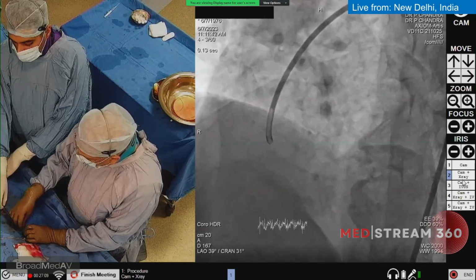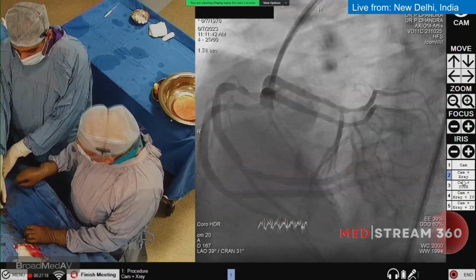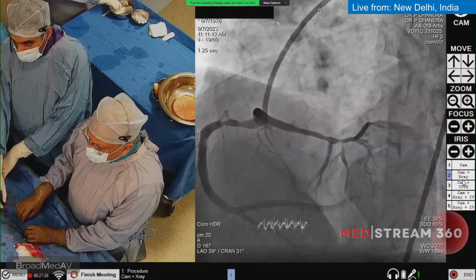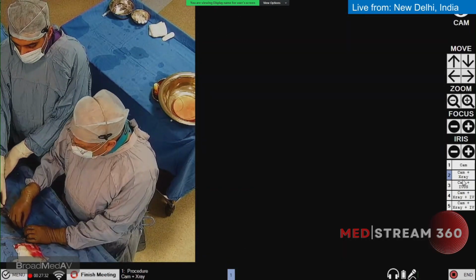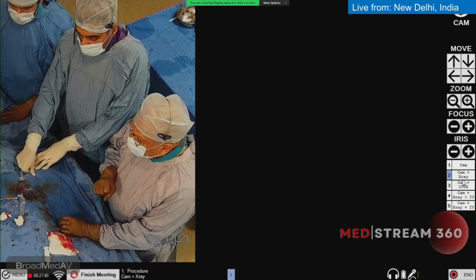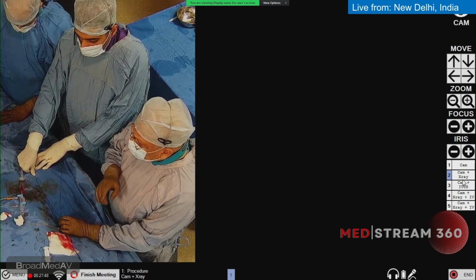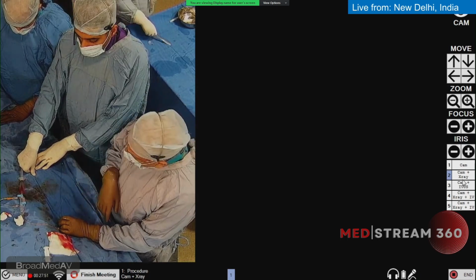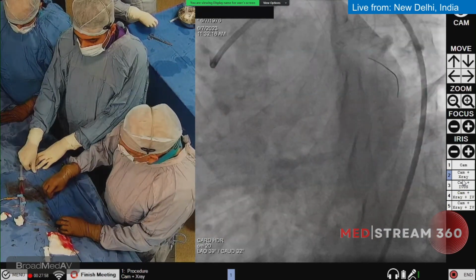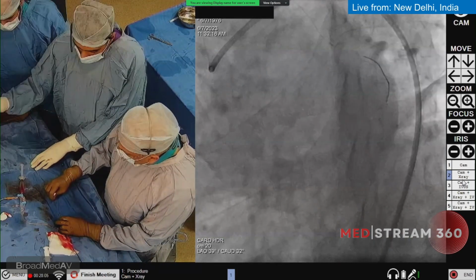We initially took a right coronary guiding catheter, which is helping us achieve wiring in the anomalous left main. We also used an extension catheter, but while the extension was in, there was some ischemia. So we took it out, and we will only use it when we are taking some device inside, and then we'll pull it out. Now we have a 2.5 into 10 cutting balloon, because the plan is to do a cutting balloon and DEB for two reasons. One, there is a bifurcation at the LAD circumflex, and this lesion is just beyond that bifurcation. And the second is that there is a lesion at the OM also, which is arising from the lesion itself. So this is a 2.5 into 10, and then we will follow it with a drug-eluting balloon, because putting a stent will lead to issues with both the LAD and the OM branches.